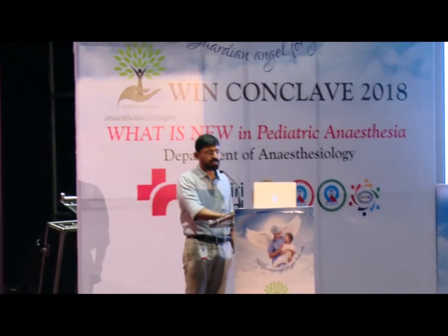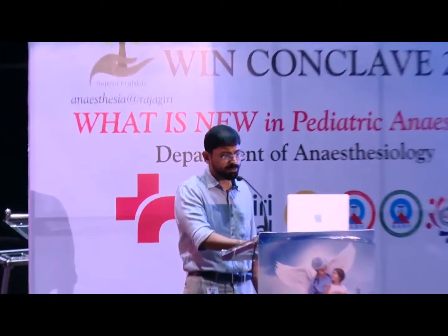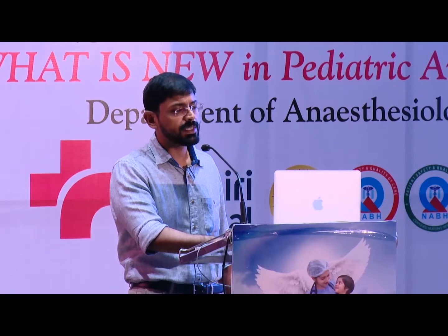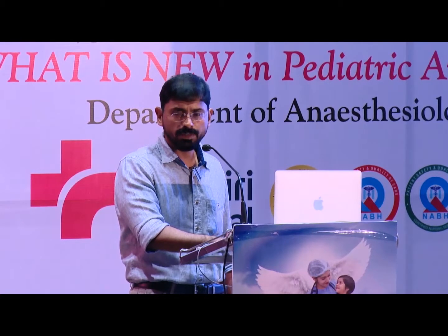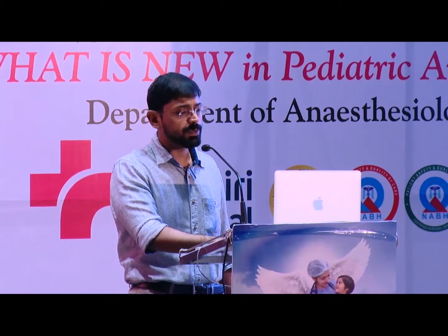So we keep the settings unchanged other than weaning the oxygen, and we repeat the gas after 3 to 4 hours. And the repeat gas also is good. 7.32 is the pH, the PCO2 is 38. So now that the CO2 has come down, the delta P is reduced. And ABG 6 hours later is also fine.